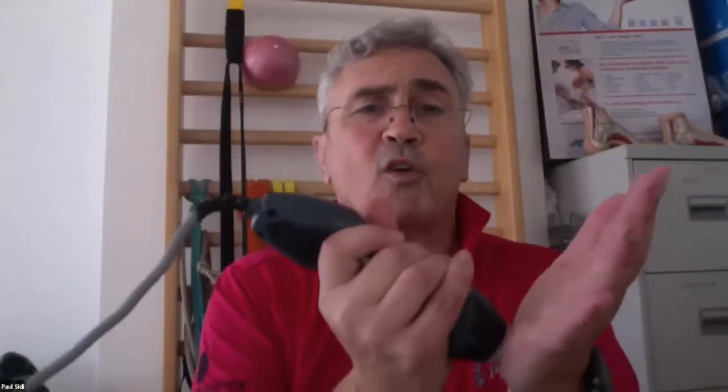Paul, can I just ask, on a large swollen knee, can you do a scan and pathology modes, both posterior and anterior aspects, during the same treatment? Yeah, you can. But what I would even do beforehand is, if it's very swollen, I'd probably use the anti-edema setting first. Clean out the lymph, just a minute or so on the lymph, up into the groin, and then I would start using the handpiece to actually move the fluids away, from distally to proximally. Just try and push the stuff away. Try and reduce the edema as much as possible, because if we do that, then we have more effect with what we're doing with the laser when we're doing a pathology setting.